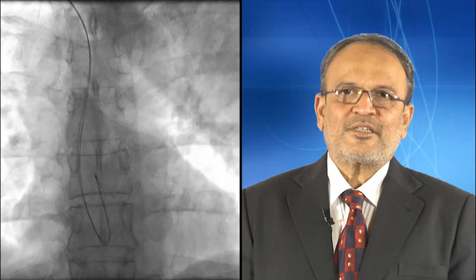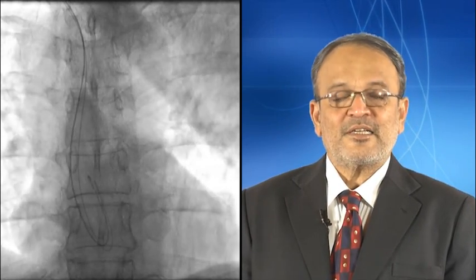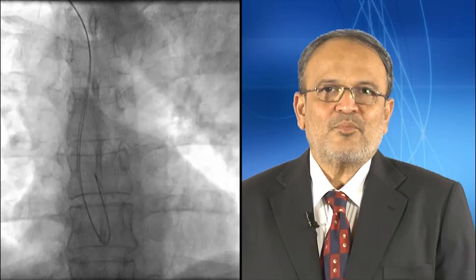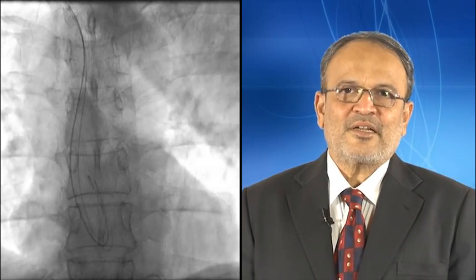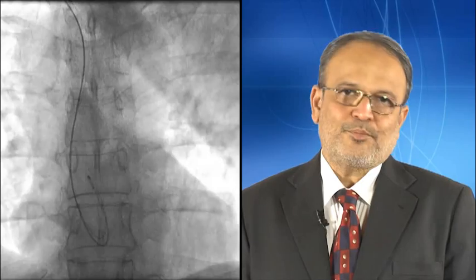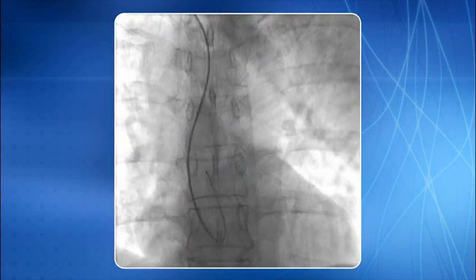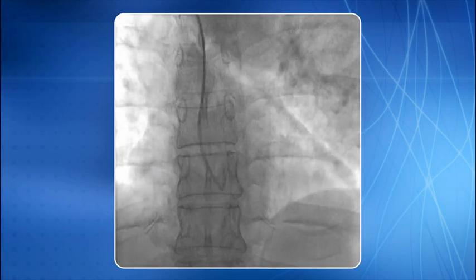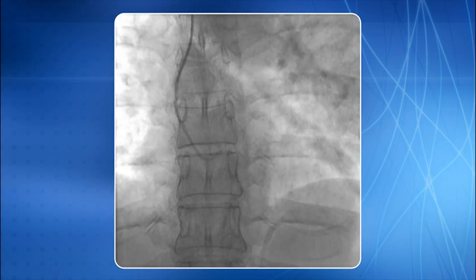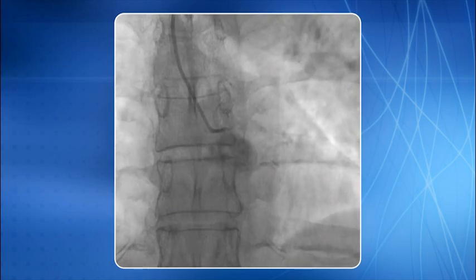I am now going to demonstrate coronary cannulation using a 5F opti-torque TIG catheter. A standard 0.035 inch guide wire is kept in the ascending aorta making a loop. The catheter is advanced over the wire into the ascending aorta. The wire is slowly removed and kept inside the catheter. A slow pullback is performed to cannulate the left coronary ostia. Cannulation is done.